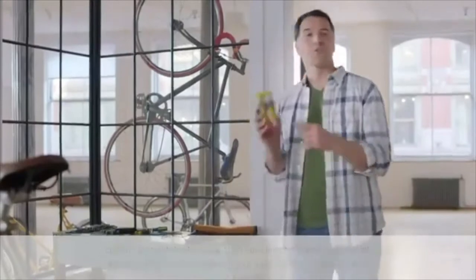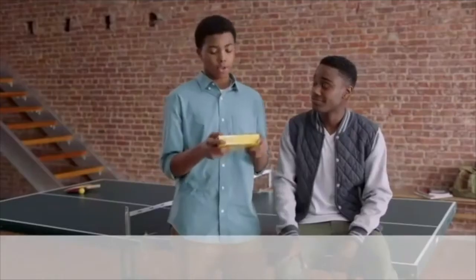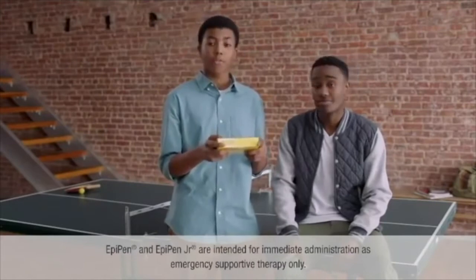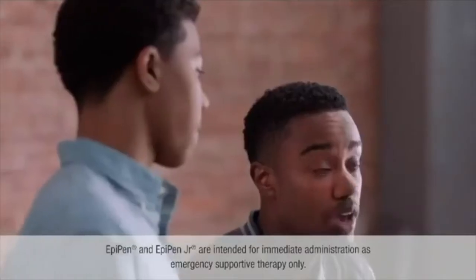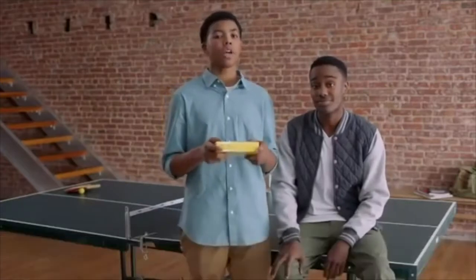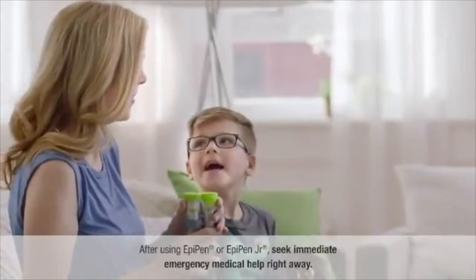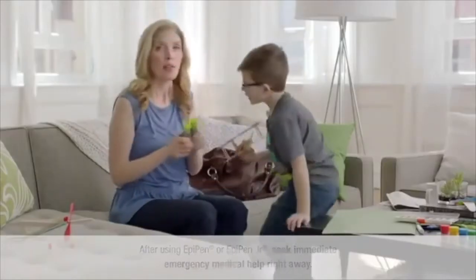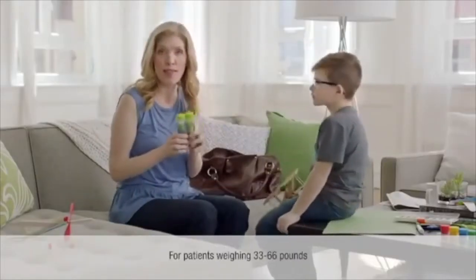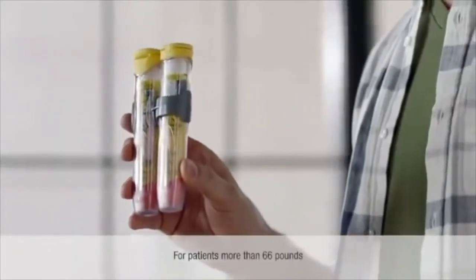It's also important to know how to use an EpiPen auto-injector. EpiPen and EpiPen Jr. are for the emergency treatment of life-threatening allergic reactions, and for people who are at an increased risk for these reactions. EpiPen Jr., the one with the green label, is for kids, and EpiPen, with the yellow label, is for bigger people.